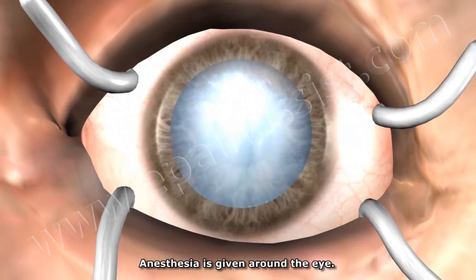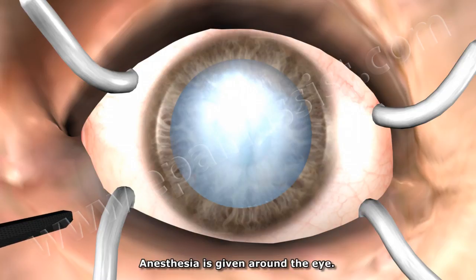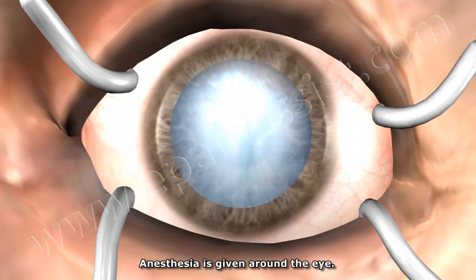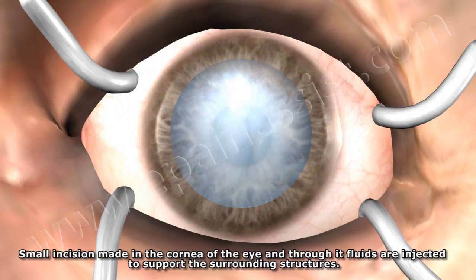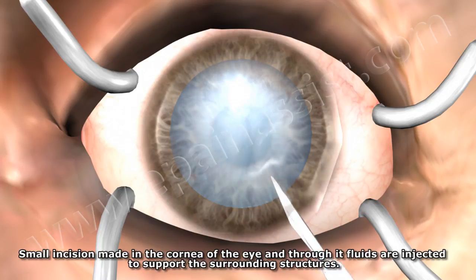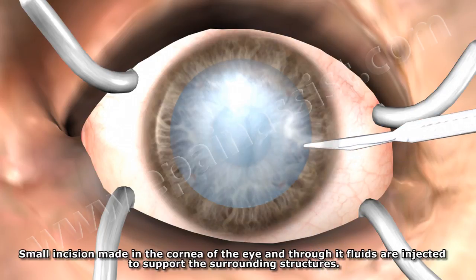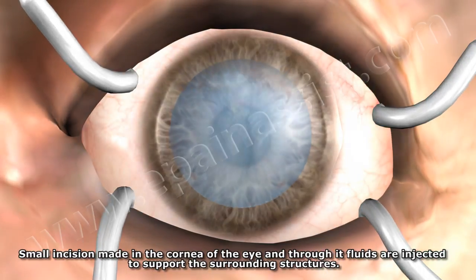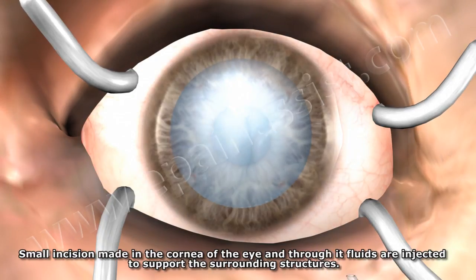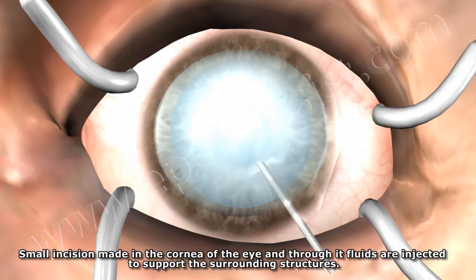Anesthesia is given around the eye. A small incision is made in the cornea of the eye, and through it, fluids are injected to support the surrounding structures.